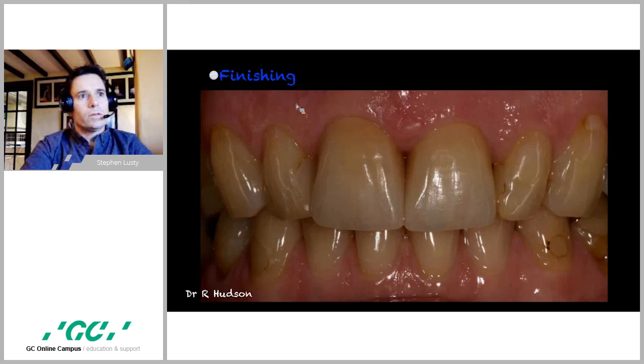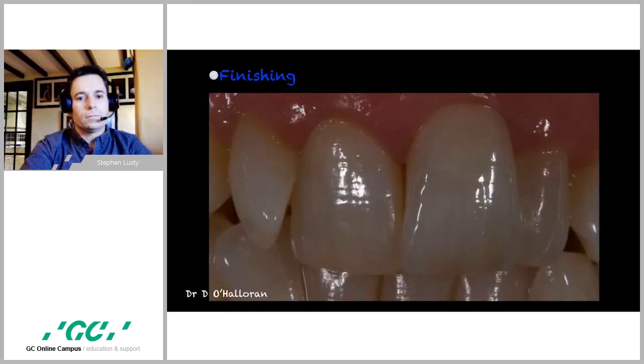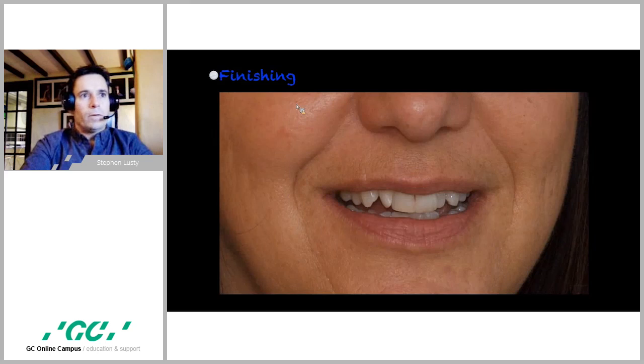So these are the results of the two centrals, and I really do wish that they'd been returned to me for higher shine and polish, but the patient is happy, so I guess that's what counts. And the result of the minimal space empty unit. But really, this is the photo that counts.